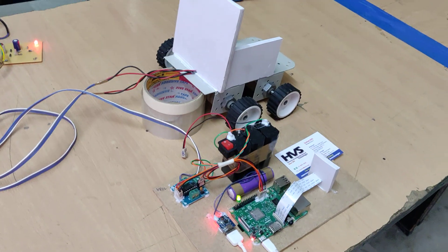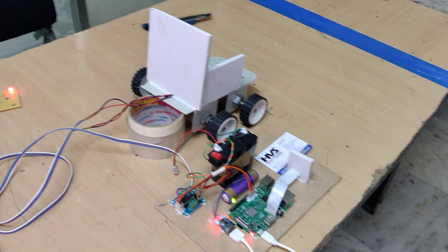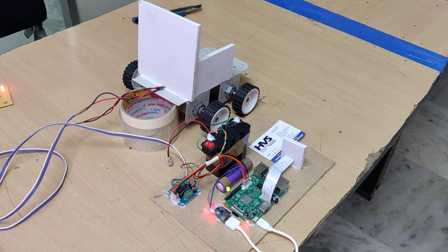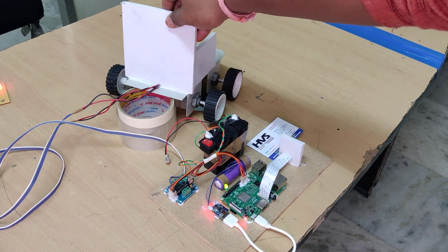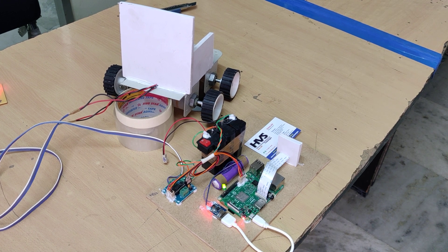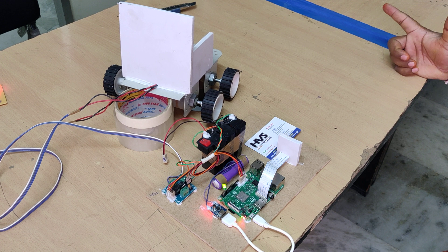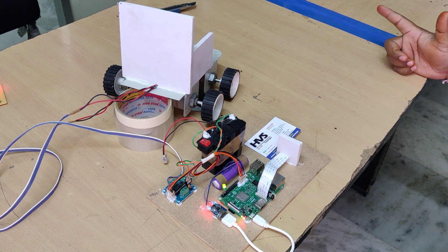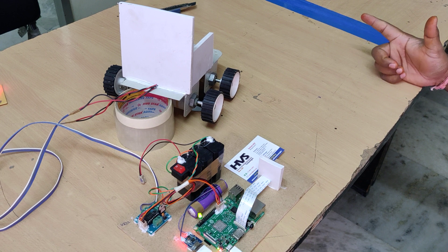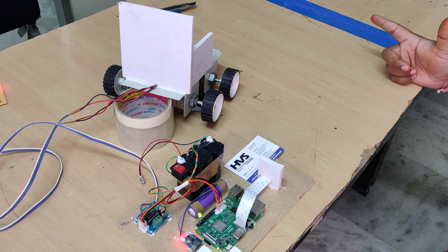Now let me show the demonstration. You can observe the wheelchair motor status. While demonstrating, make sure there is sufficient lighting on your hand — only then will the system detect the gestures properly.